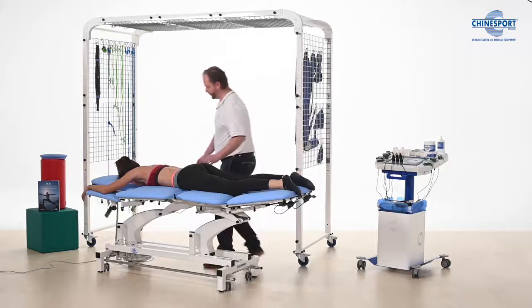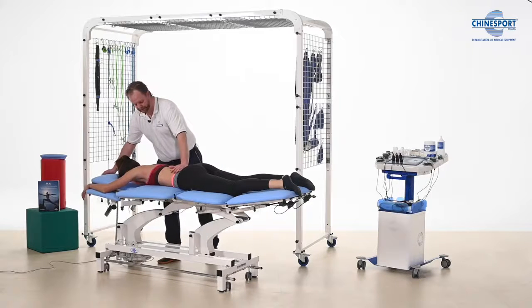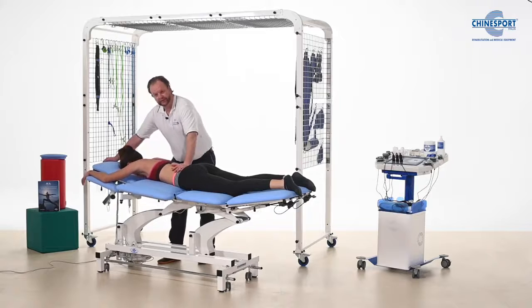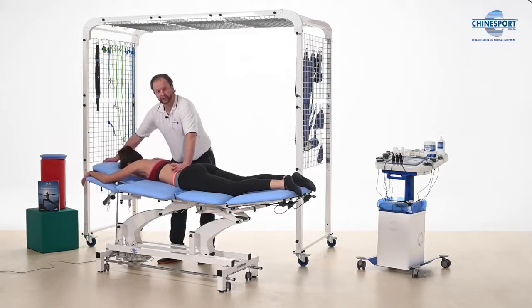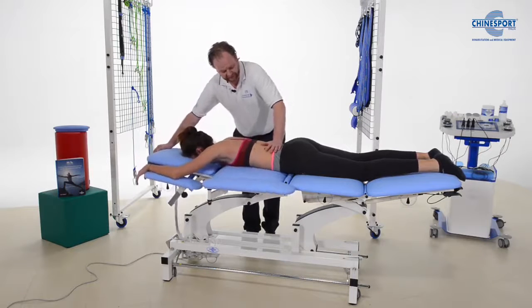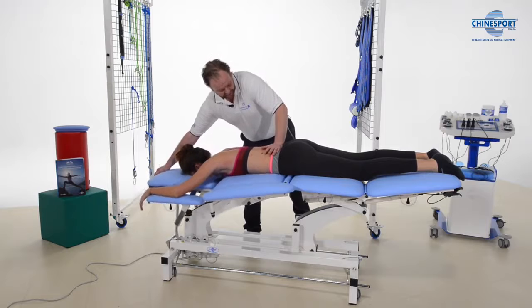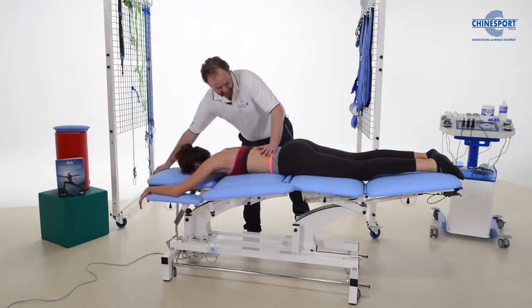We want to use the Mackenzie principles. We can go into extension by using the upper controls. We can go up and down into extension and even to flexion if we want. If we want to block some segments, we can do that with our hand here.